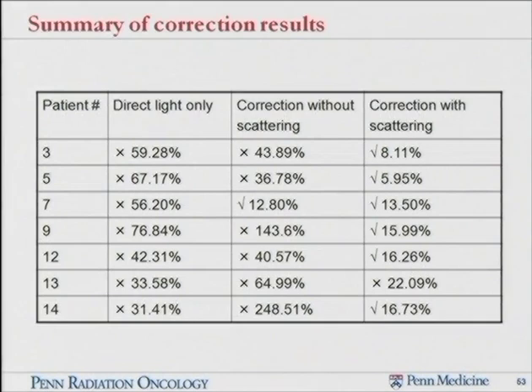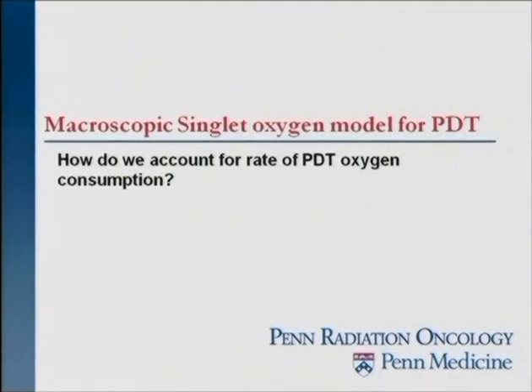This is the maximum difference from one of the 7 detectors, so they have to be compared simultaneously. This is very encouraging if we take into account the scattering, which in our case is just a constant. We introduce a constant factor, which you can decide from this correction mechanism. You can have the majority of patients agree. I am using close to 15% as agreement. So the majority of them can actually have a reasonable agreement, which will be very good for us.